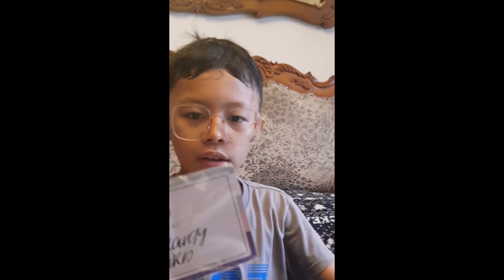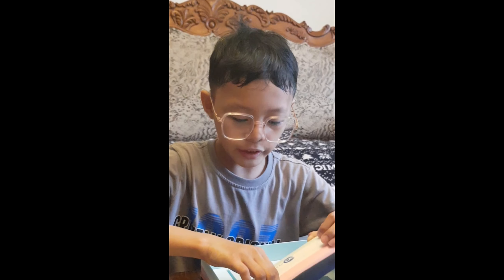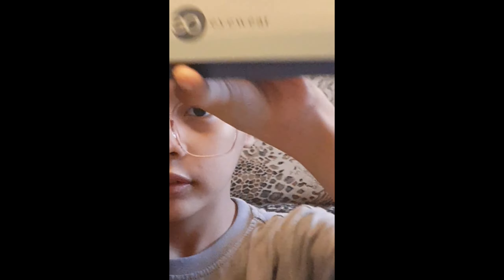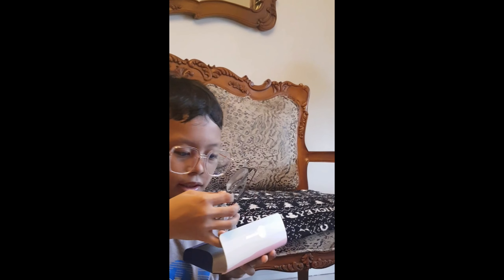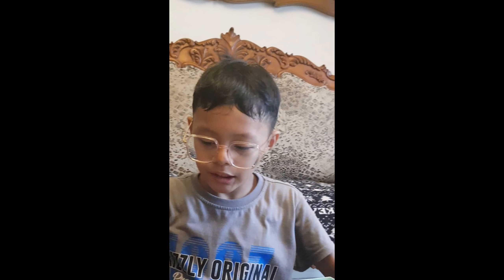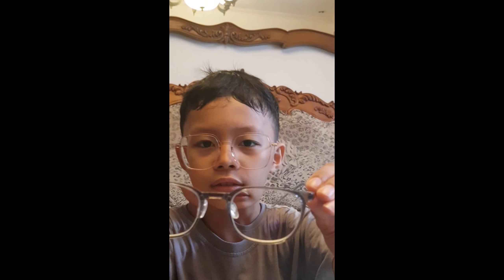And this is the mask — and do be aware. And this is where the eyeglass goes. It says 'Love your eyes.' And this is the eyeglass.